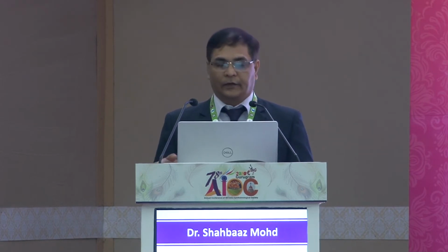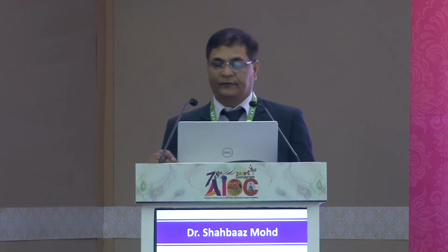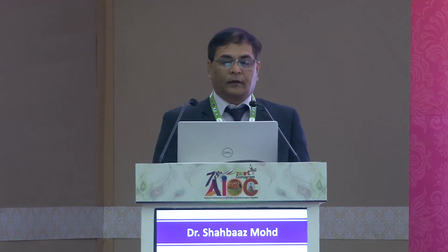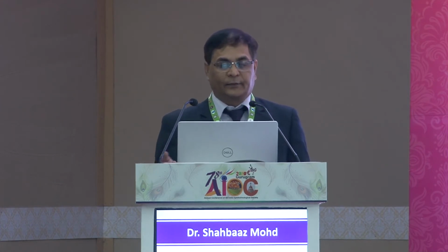Manual mode is for when you are not able to take readings with the automated mode. Again, you have to see the scan. When you are doing manual mode, you have to see the scan and then freeze. In a normal scan in a phakic eye, you have 4 spikes from the cornea, anterior lens, posterior lens, and the retina. So axial length is from the corneal spike to the retinal spike.